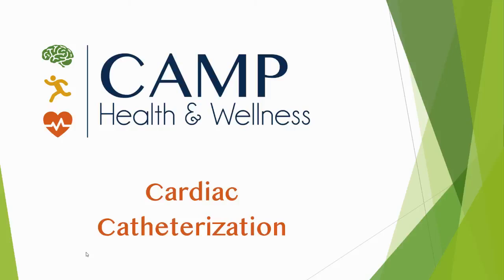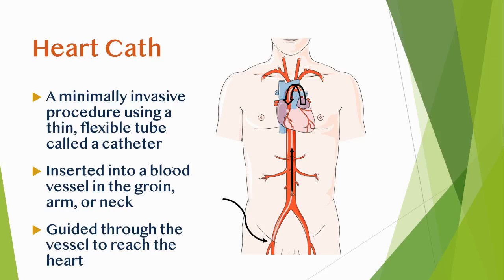All right, guys. So we are going to talk about cardiac catheterization this week. Cardiac catheterization is also known as a heart cath, and it is a minimally invasive procedure. However, it is invasive. They do actually insert something into your body. So, a minimally invasive procedure that allows your doctor to examine your heart's function.